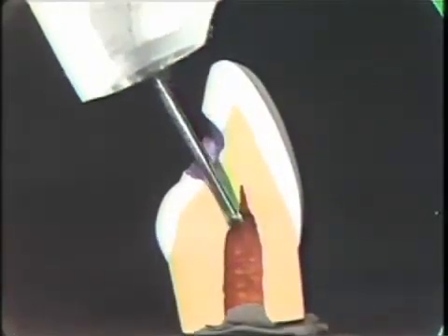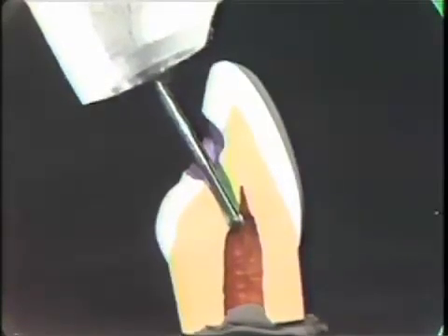Once you feel the burr drop into the pulp chamber, stop the handpiece from running. Now that the burr is in the pulp chamber, we want to unroof the pulp chamber working from the inside out. With the burr not running, we want you to feel around the anatomy of the pulp chamber a bit, just so you'll make sure that you know where the roof is and unroof that, as opposed to gouging the walls. So you can stick the burr a little bit on farther down, feel where the walls are, run the head of the burr against the walls with the handpiece off.